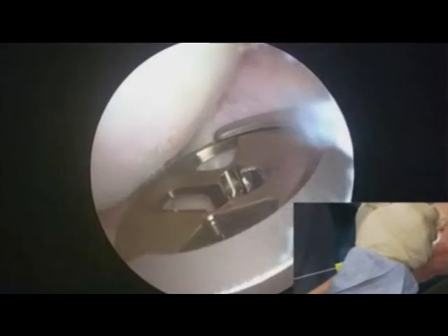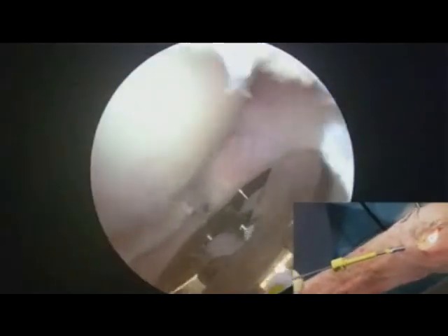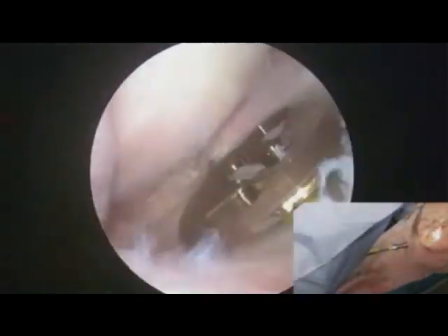So now that we're locked, we can safely let our blade go. And what I do is unlock it and then pull the device out. So you can see we now have a construct in the knee joint that allows us to cut. We're going to get our drill set up here. The beautiful thing about this blade is that it's set up so that even though it may abrade the meniscus, it's not going to necessarily cut it.